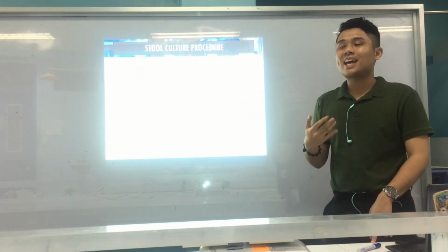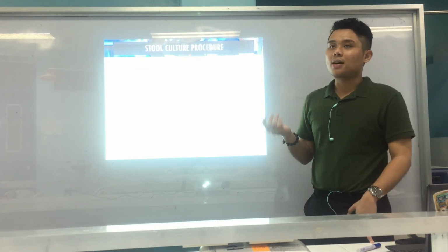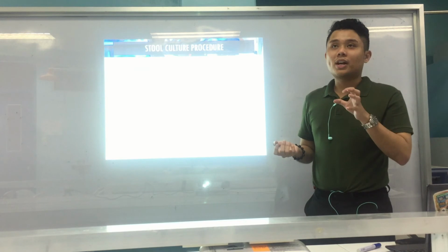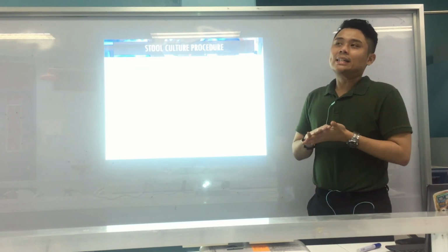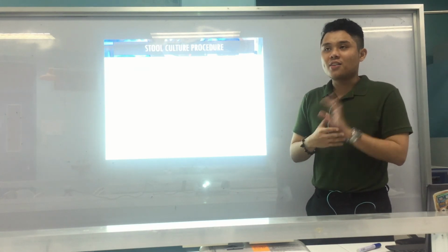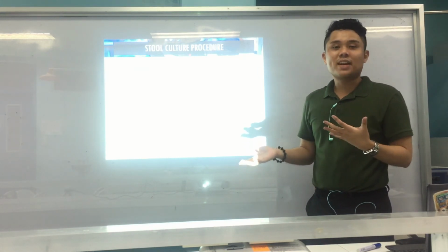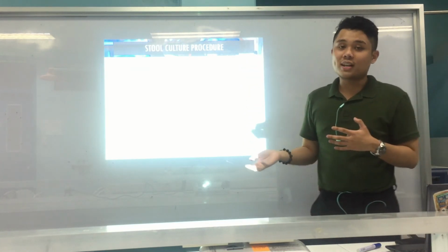Usually for enteric diseases like gastroenteritis or diarrhea, what we're really looking for are the true pathogens. For example, Salmonella, Shigella, Yersinia, you have Campylobacter also, you have Vibrio, E. coli O157:H7. And Salmonella and Shigella, for example, on MacConkey, those are of course non-lactose fermenters.